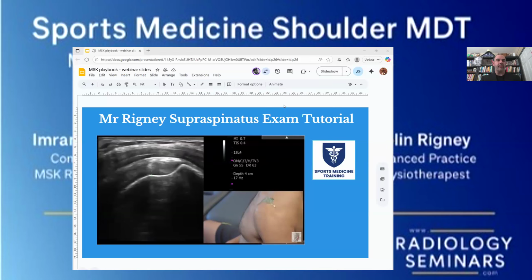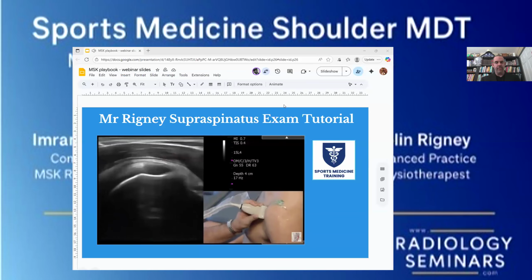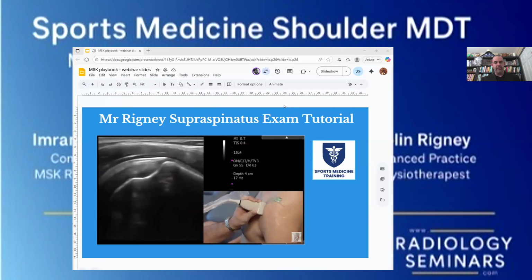The subacromial peribursal fat layer is basically from here to here, and then over the top is our deltoid muscle, with the subcutaneous layer on the very top. Now, some nice things you can do with the ultrasound that separates it from other imaging modalities is the dynamic aspect. I got you. Let me just take your elbow.